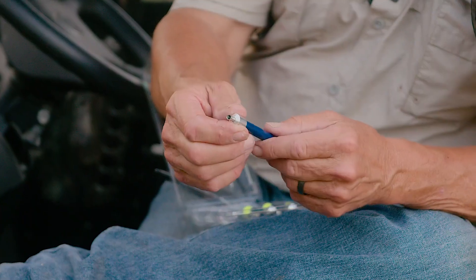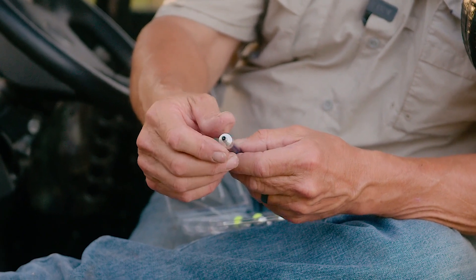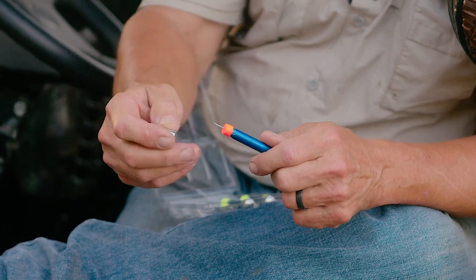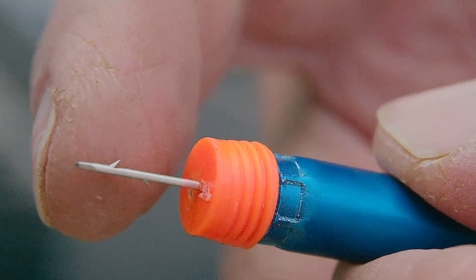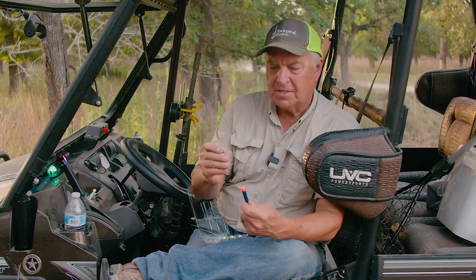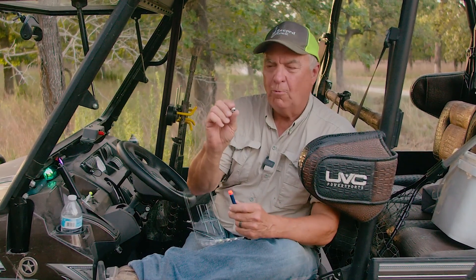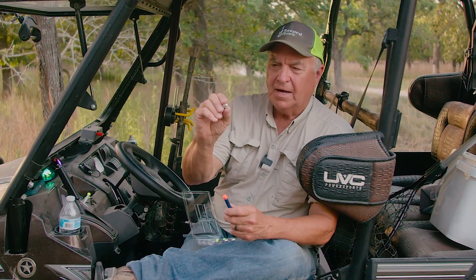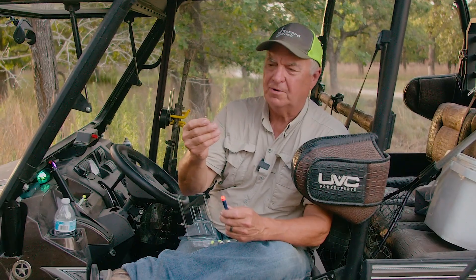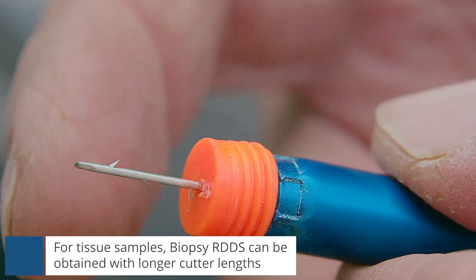Take a look at this. First off, you'll notice the end of it is hollow. It has a little needle in there, and this end actually unscrews. You'll notice, if you look real close at this needle, it has a couple of small barbs on there. The reason those barbs exist is to actually hold the sample on the needle. It's really like a hole punch — it hits their body and cuts them, just a small cut, smaller than an eraser. It goes inside that hole and sticks right here on these little barbs.